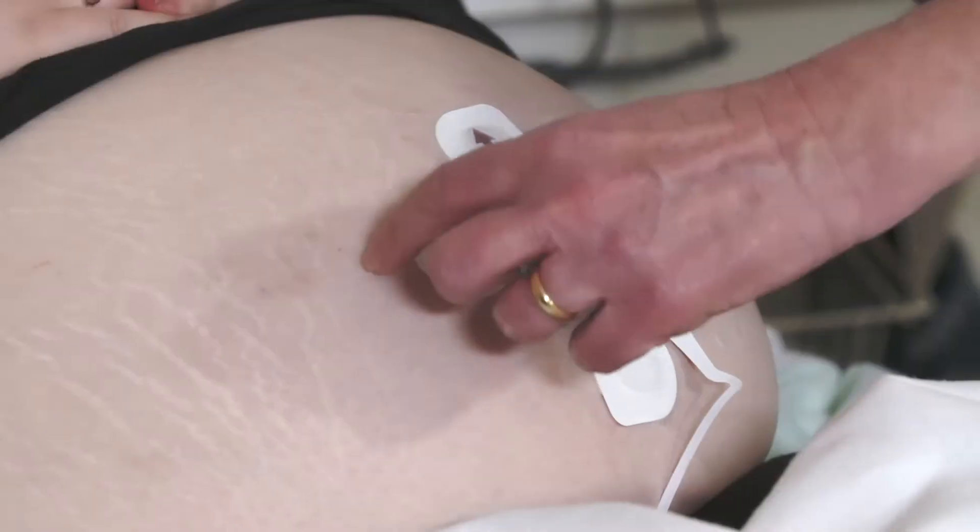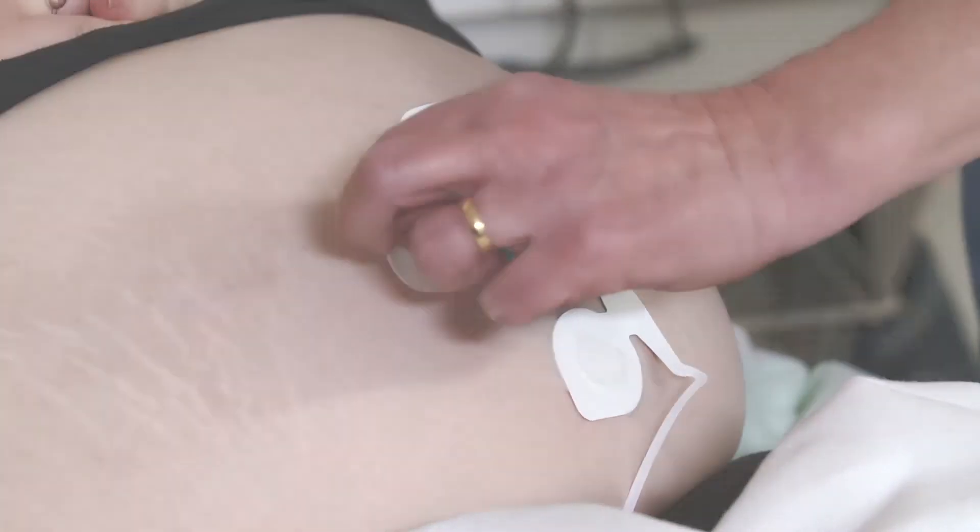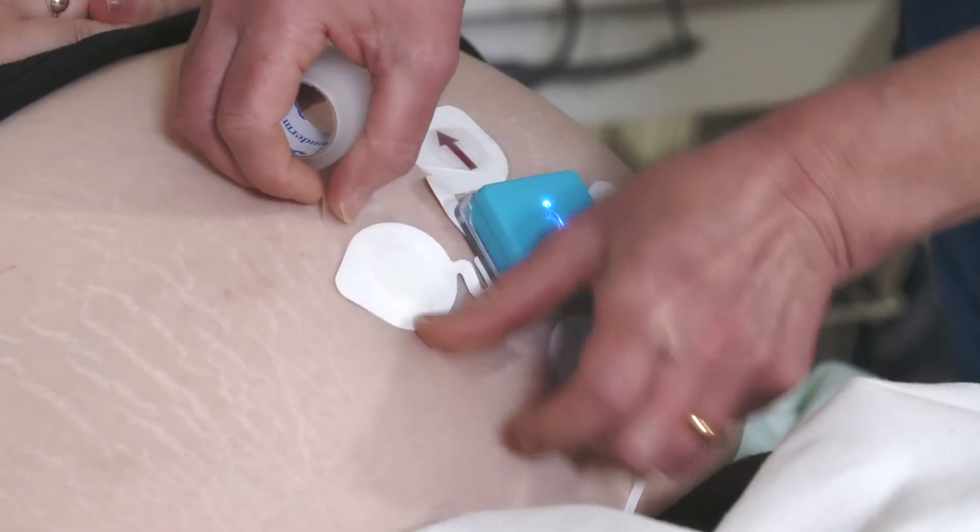An electrode has come detached. This will be flagged up by the Novi system and should be corrected.